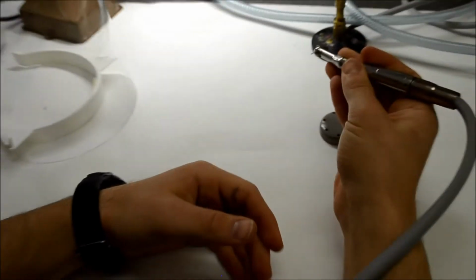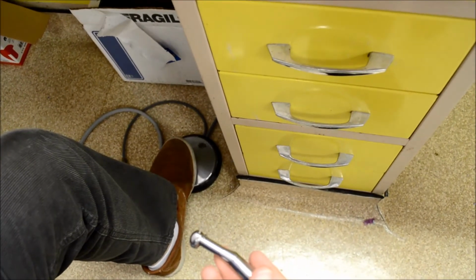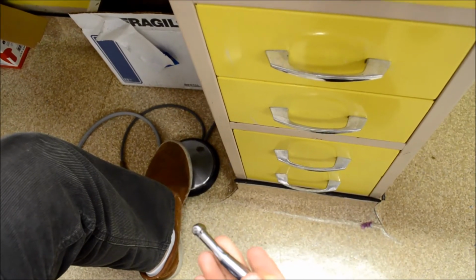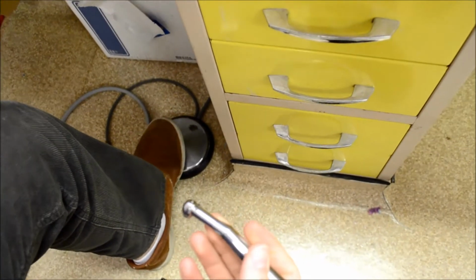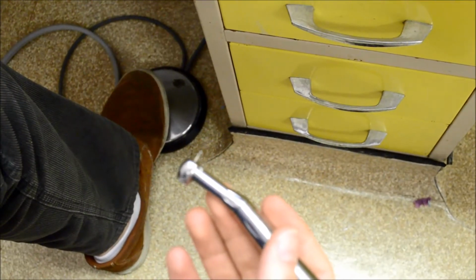To get the burr going, you press on something called the rheostat, which is underneath your benches. It's like the gas pedal of a car, and the harder you press, the faster the burr turns. So a good way to get some practice initially is to press on the rheostat lightly and drill, press on it hard and drill it, and see what happens.